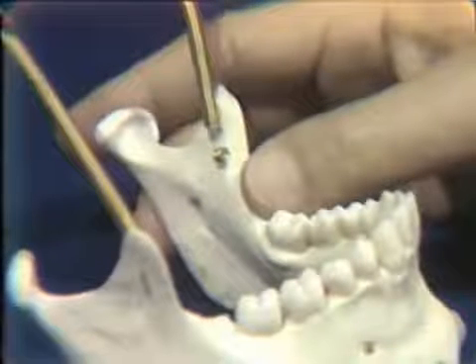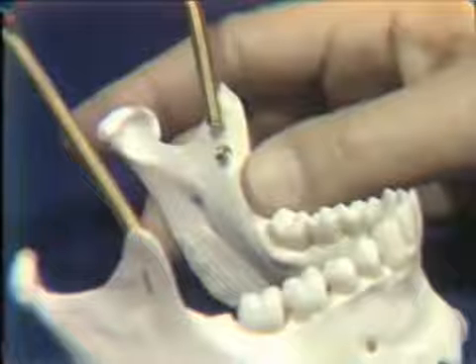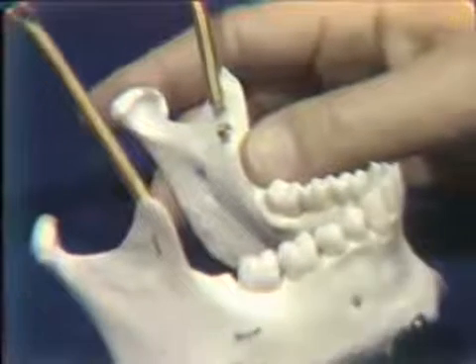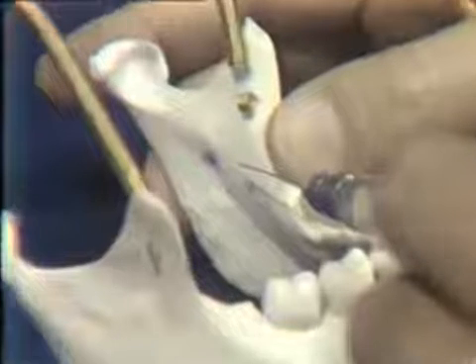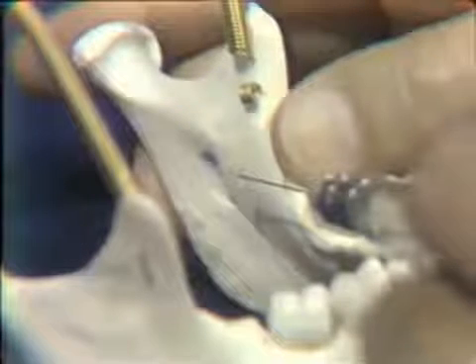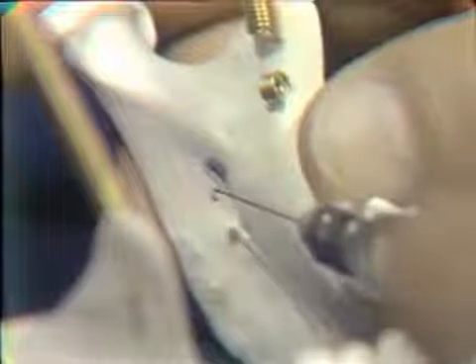Then we back our thumb off, otherwise we'd be covering our injection site. We make the approach with the syringe with the barrel on the opposite side, approximately over the bicuspids on the opposite side. The puncture is made, and you will note if our thumb is in the right position, it appears as if we are bisecting our thumbnail. We carry on in 1.5 centimeters or so, and then increase the angulation of the syringe so that now it is about over the first molar.